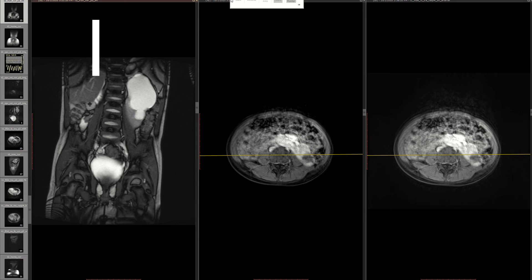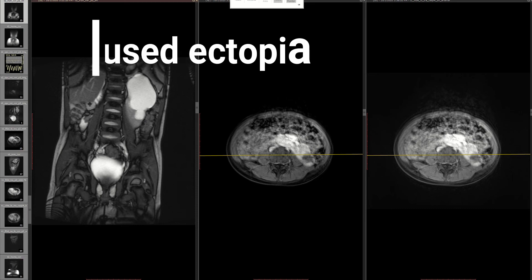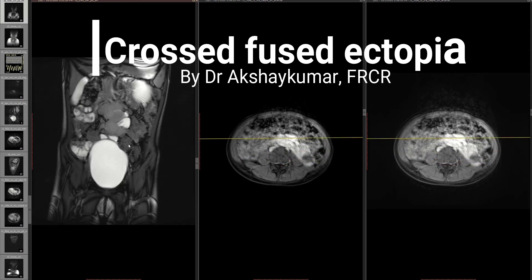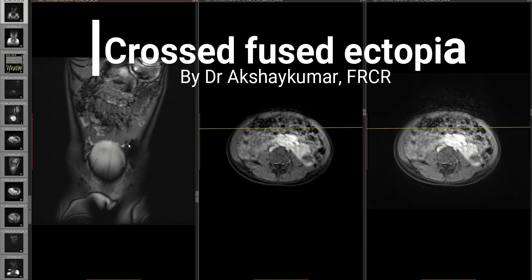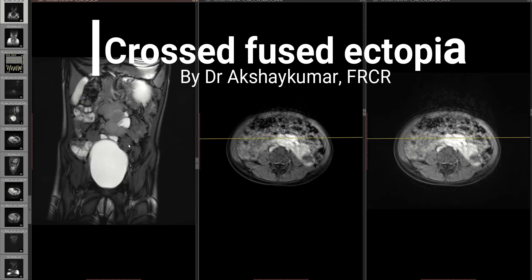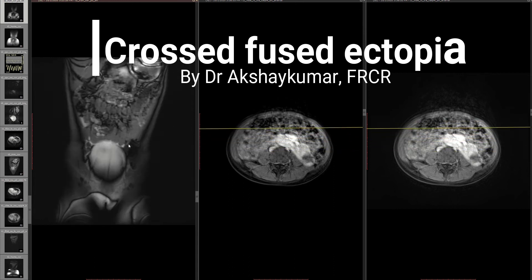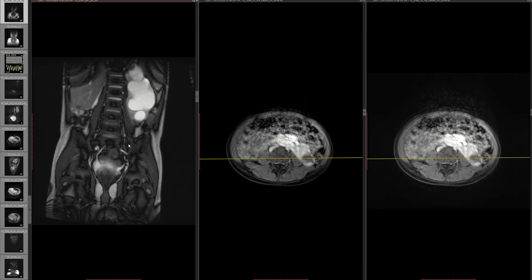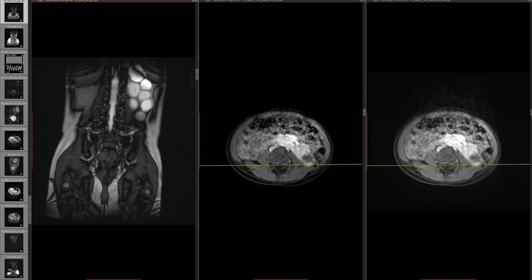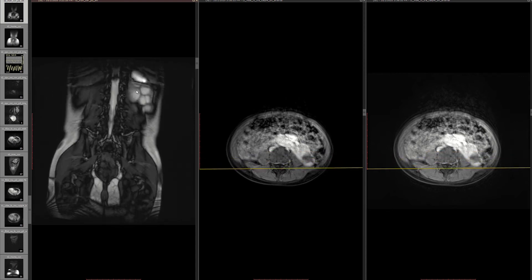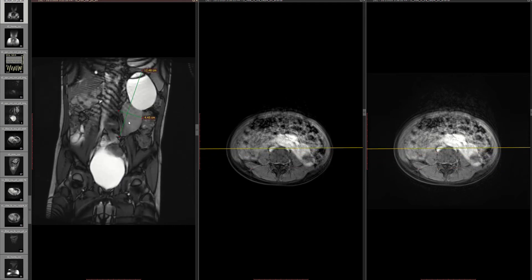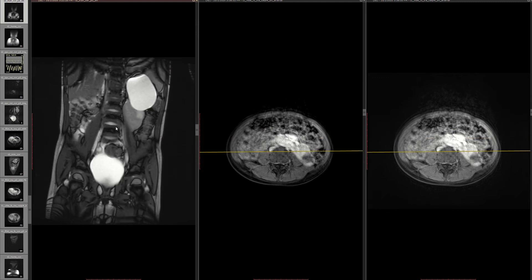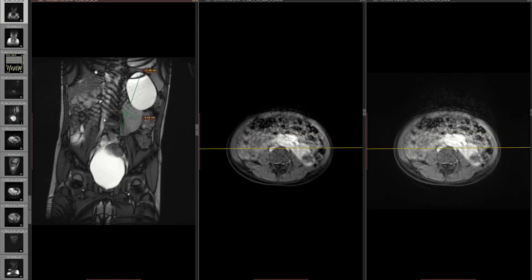The ultrasound was done and the query was whether this is a horseshoe kidney. When I scrolled through the T2 coronal images, I thought — this is not horseshoe, because I can see the left kidney which is obviously showing gross hydronephrosis, and there is here the other moiety.